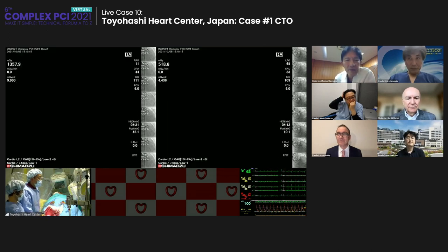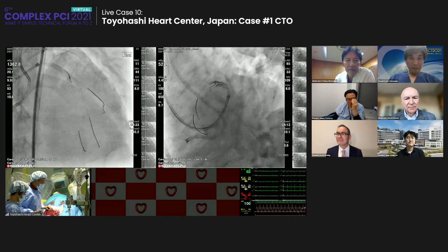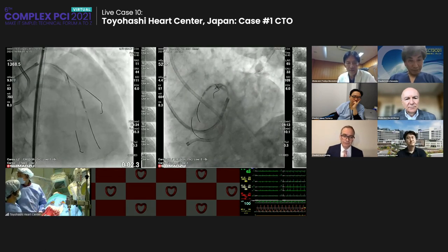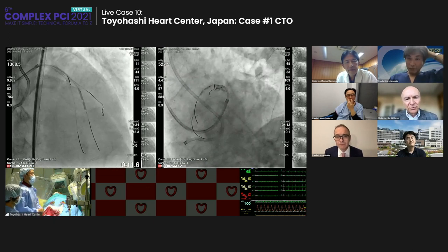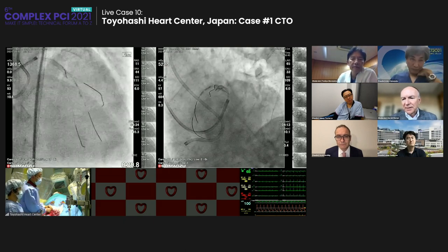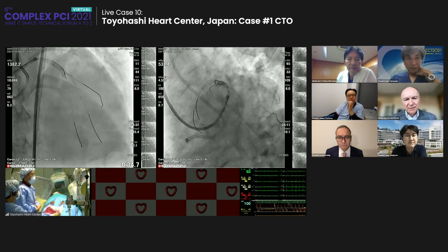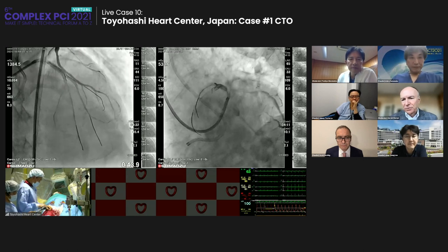Yeah. Thank you. What's your definition? I think if you can't restore it, of course you will do IVUS. What the whole case, including the history before, tells us, as was mentioned before by Scott or Sydney, is that we need to emphasize imaging in these complex lesions. Unfortunately, in our part of the world, it's not reimbursed, and that makes people hesitate to use IVUS in complex lesions. And to do something like that without proper imaging, I think, is doomed to fail again.